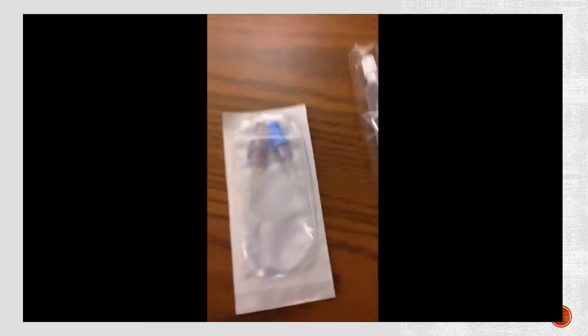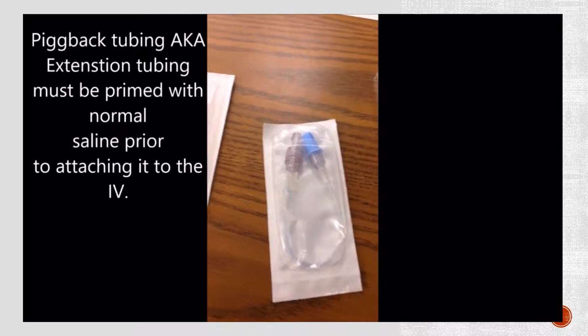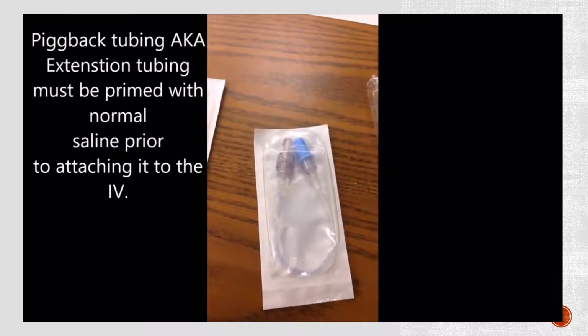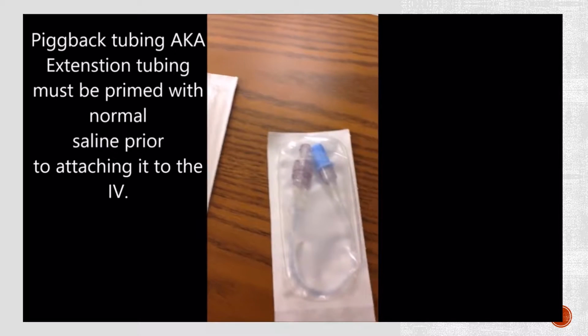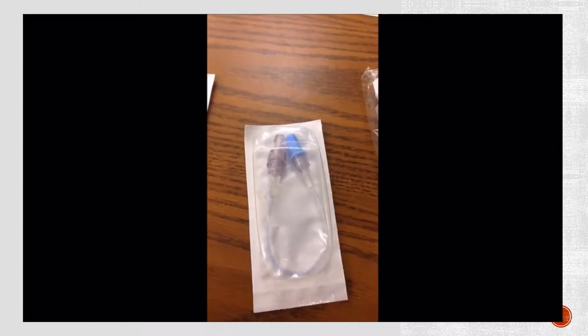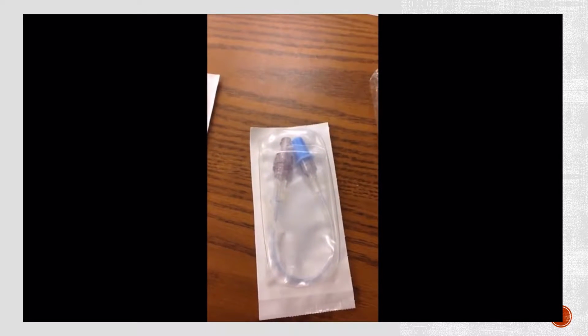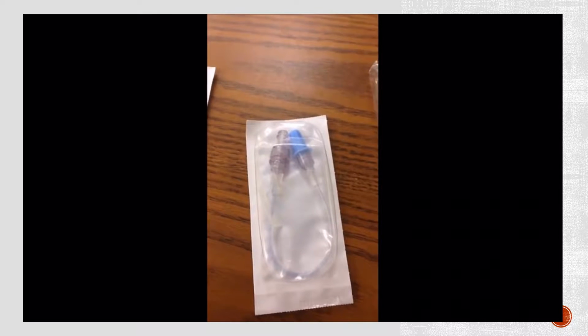Here you have your piggyback tubing. Often people will use this to hook onto the IV catheter after you start it. It's always important that you prime this tubing with some saline before you hook it up, before you even attempt to start an IV. And this is a saline flush.